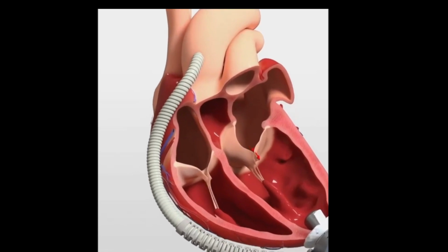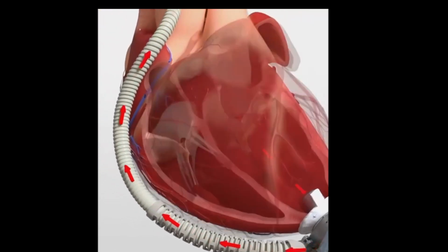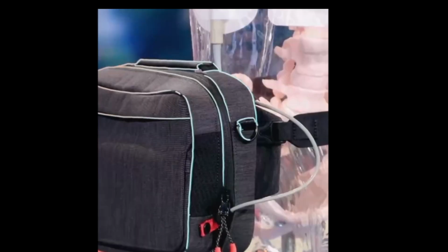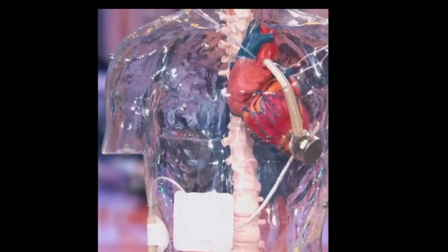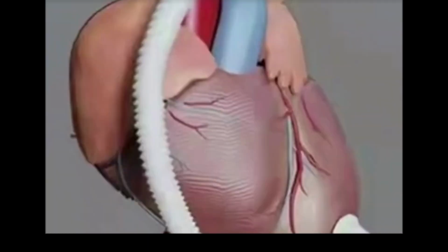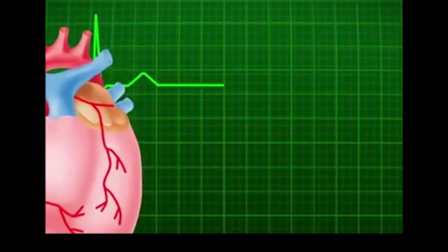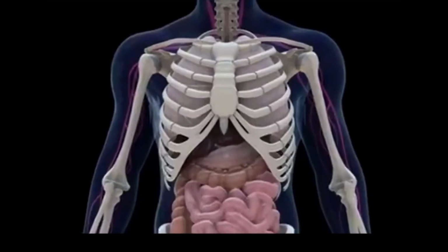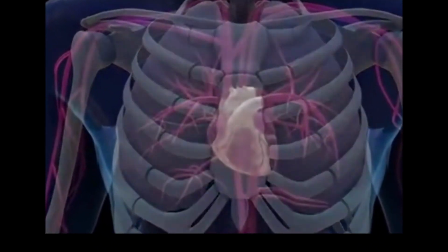The artificial heart has one inlet and one outlet, and its inlet is fixed to the left ventricle. The outlet is connected to the aorta, and blood from the left ventricle is pumped out and then pumped into the aorta. This can partially replace left ventricular function, thereby improving the symptoms of left heart failure in patients and restoring normal life. The traditional treatment method is only heart transplantation, but due to donor limitations, patient rejection, infection, and other issues, the number of heart transplants that can be completed in China every year is only a few hundred, which cannot meet clinical needs.